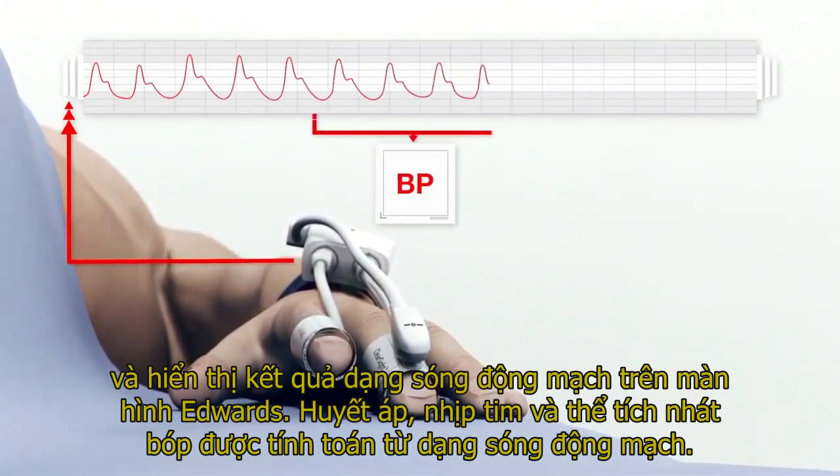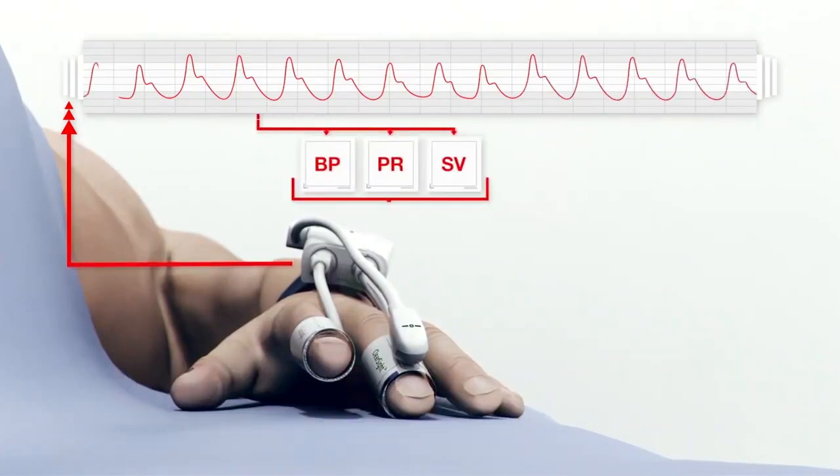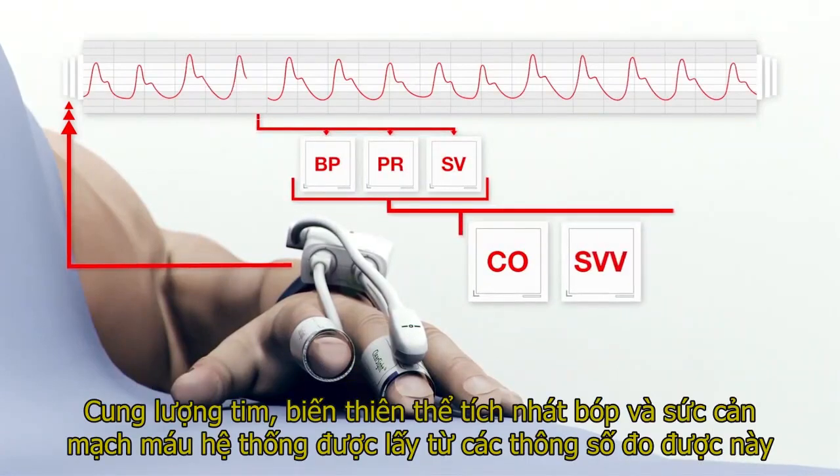Blood pressure, pulse rate, and stroke volume are calculated from the arterial waveform. Cardiac output, stroke volume variation, and systemic vascular resistance are derived from these measured parameters.